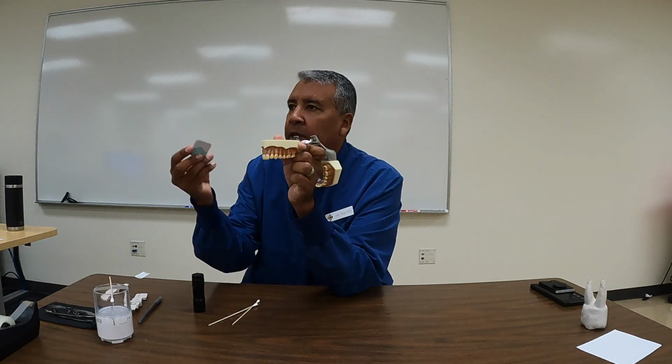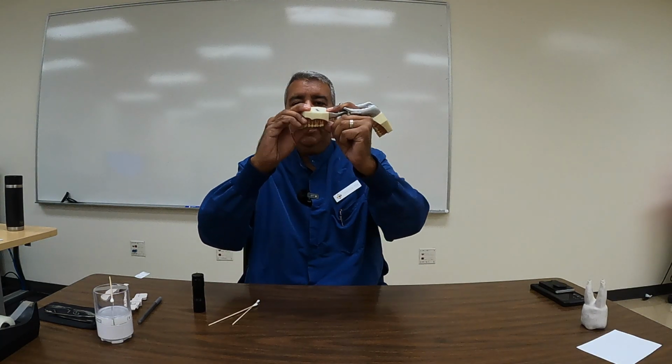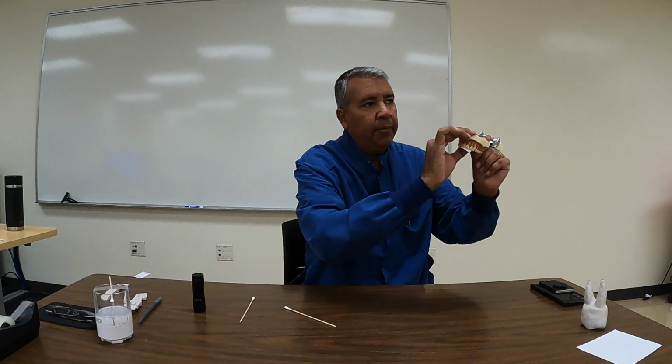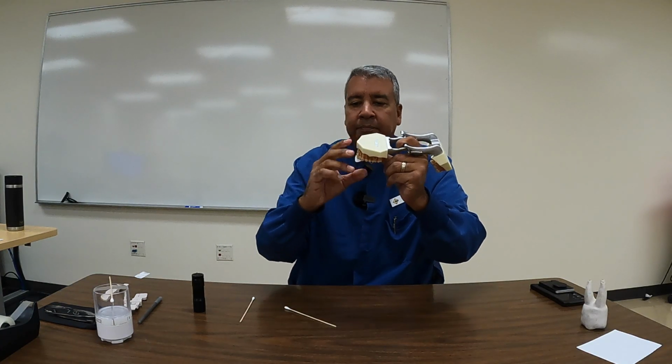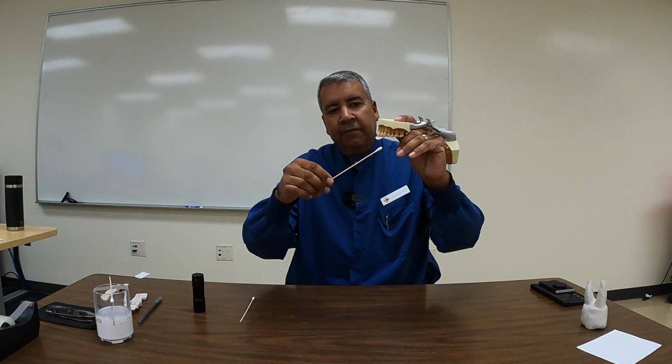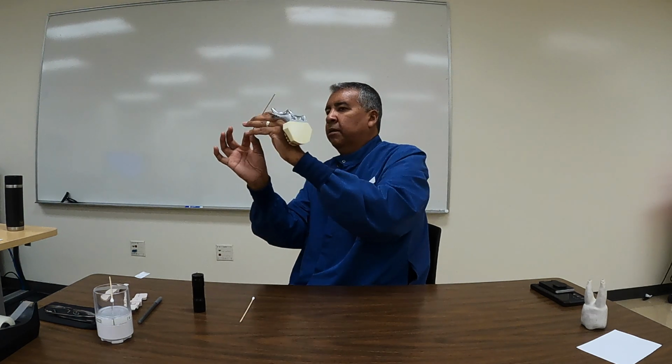Okay, so let's take a periapical, and let's just say that we're going to do it on these anterior teeth, these 4 anterior teeth. So if we take the film and we place it inside the mouth, and we have it at an angle, you can kind of see the angle of this thing. It's coming at an angle like this, and I have it right up against that palate. The closer these two angles are together, the easier your life is going to be a little bit. And it's stable in that patient's mouth a little bit. But that is the angle. So if the angle of this film is at this angle, you already have one angle down, right? One angle's already down.